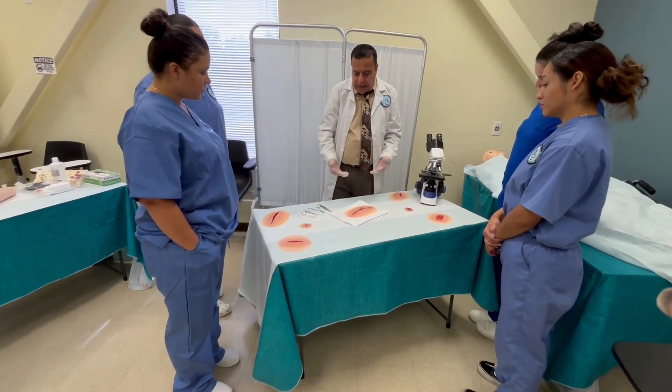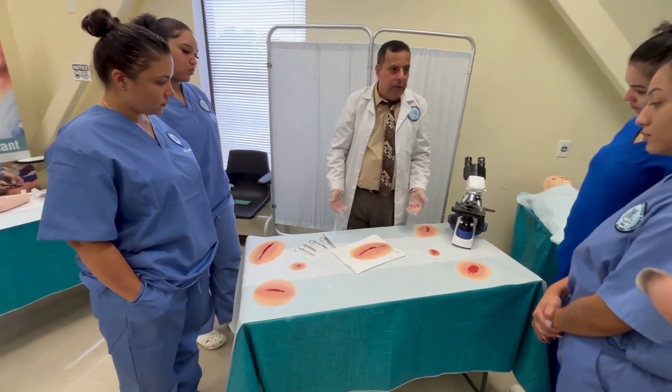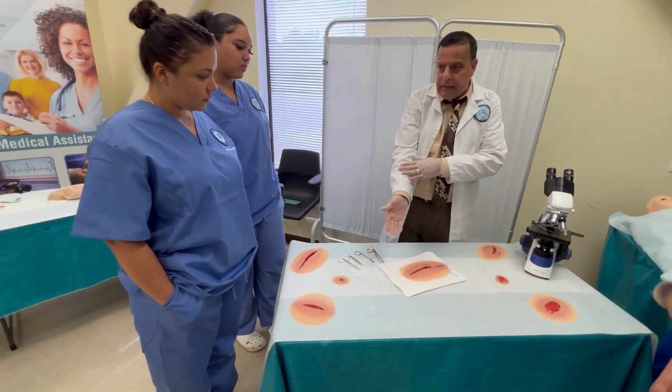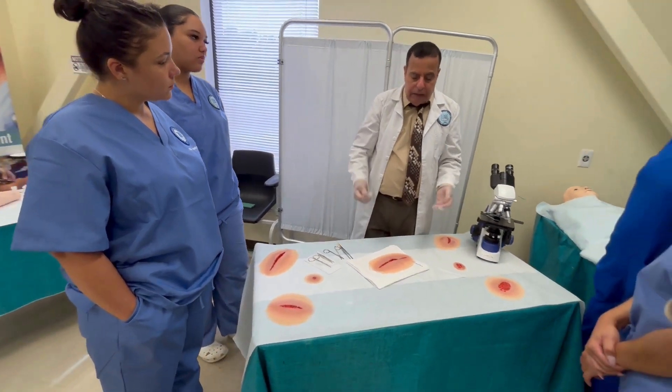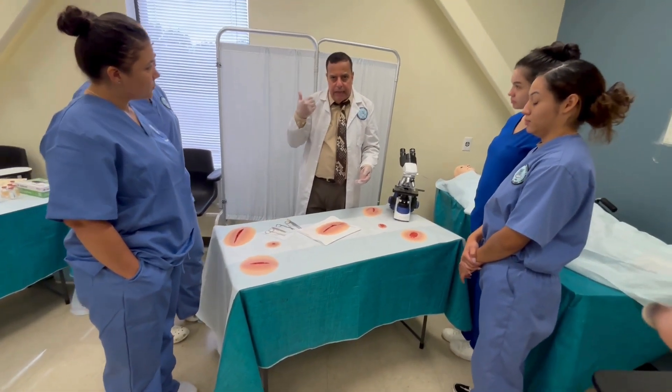The physician has asked me to remove the stitches. Keep in mind that stitches in thick skin, like the arm and the leg, need 15 days to heal. But if it is soft skin, like the face, only three to five days.